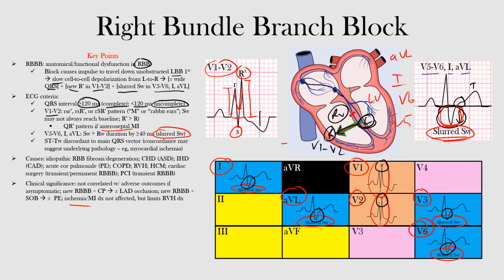Well, that's the end of this lecture. We discussed right bundle branch block, including its pathophysiology, EKG features, potential causes, and clinical significance. I hope you learned something.